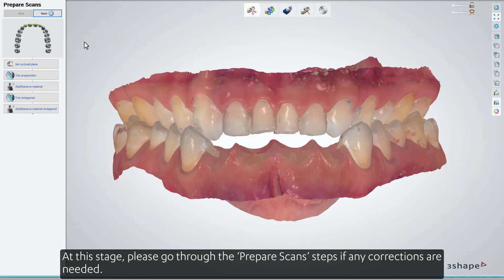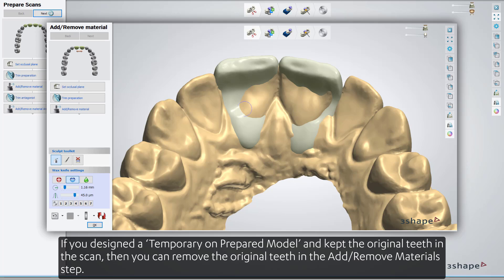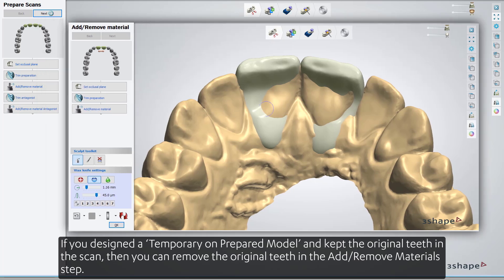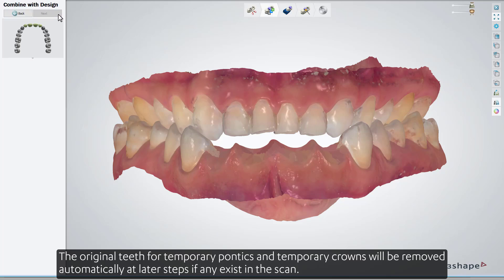At this stage, please go through the Prepare Scan steps if any corrections are needed. If you designed a temporary unprepared model and kept the original teeth in the scan, you can remove the original teeth in the Add-Remove Materials step. The original teeth for temporary pontics and temporary crowns will be removed automatically at later steps if any exist in the scan.